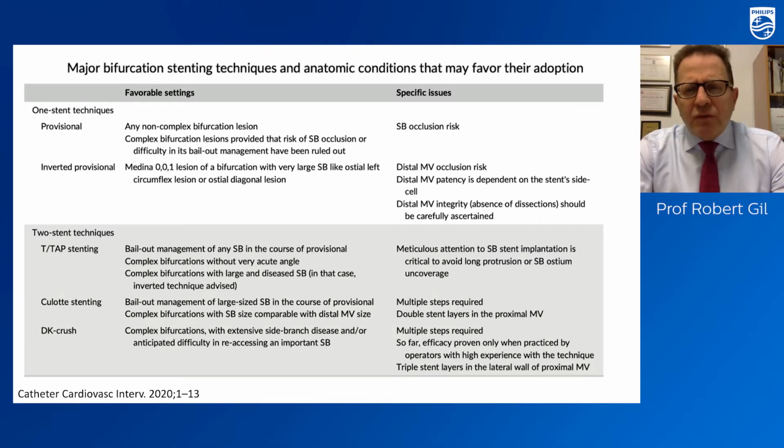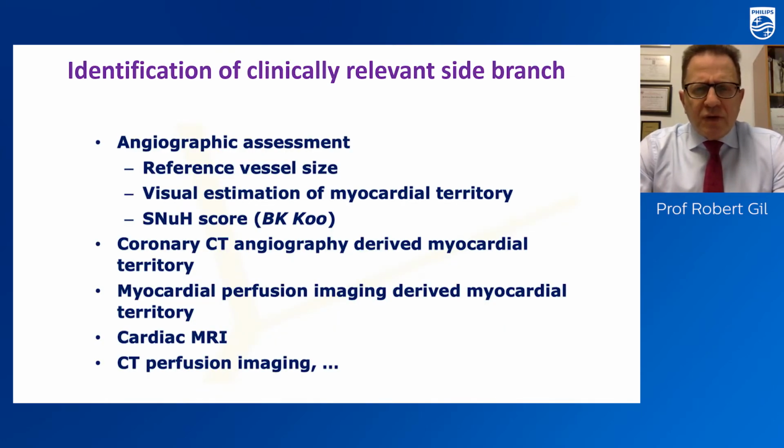However, we have to remember that with one stent we can easily lose the side branch, so we have to be prepared for that. The one stent approach doesn't mean that this is the only step which should be used, and we also have to remember some biases associated with two stent techniques, such as the problem of additional metal layers facilitating thrombosis or restenosis, for example.